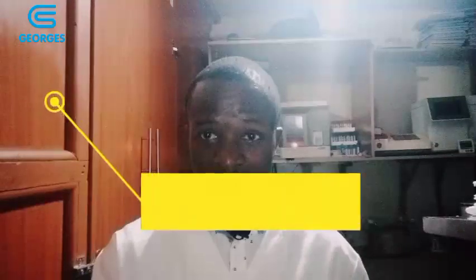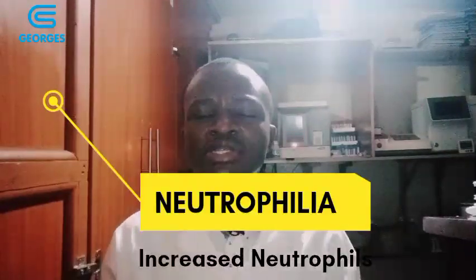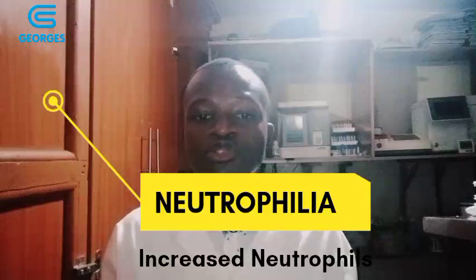So when there is an increase in the number of neutrophils in your system, we say that this is a condition that is called neutrophilia. So what are some of the conditions that can lead to neutrophilia, whereby your body has a high amount of neutrophils?